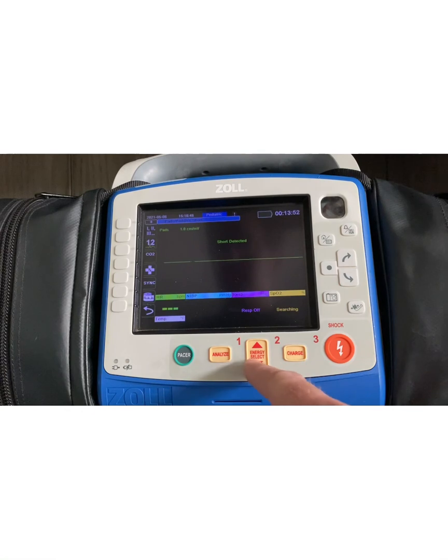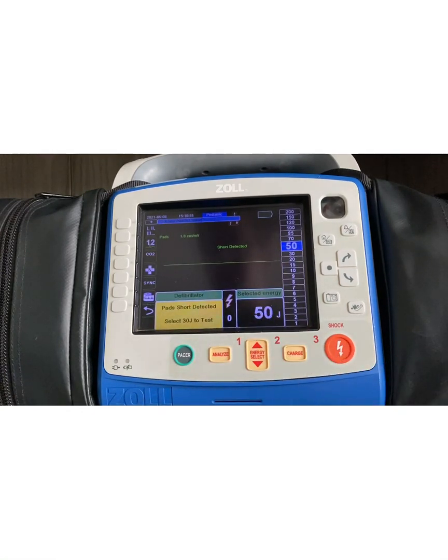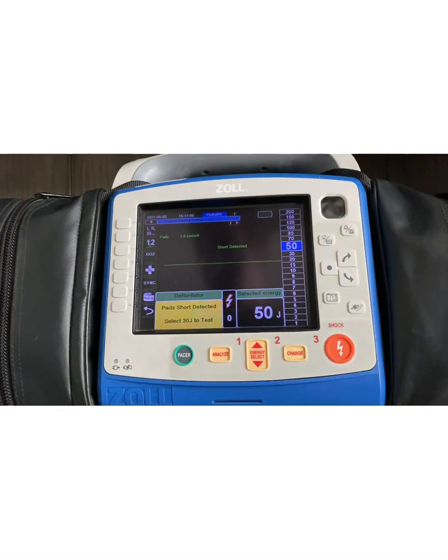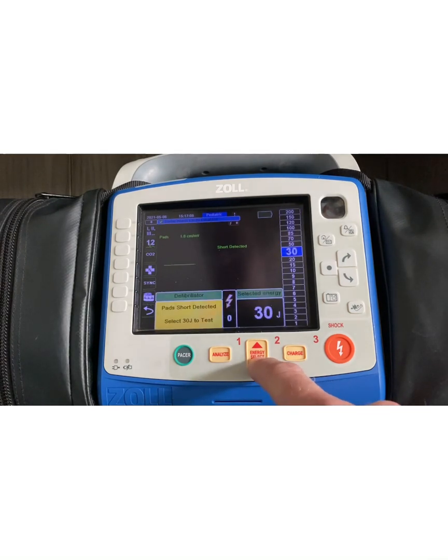The biggest change is that it's going to drop the joule settings from 120 joules down to 50 joules automatically. As a BLS provider, you can allow the machine to operate and auto-escalate from 50, 70 to 85 joules. As an ALS provider, you have the option to dial in your two to four joules per kilogram based on the patient's weight. Once the pads are applied to the patient's chest and you start performing CPR, you'll get real-time CPR feedback on those pediatric patients.